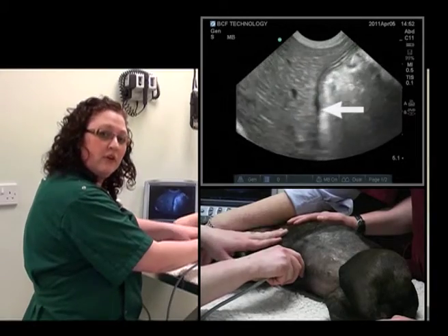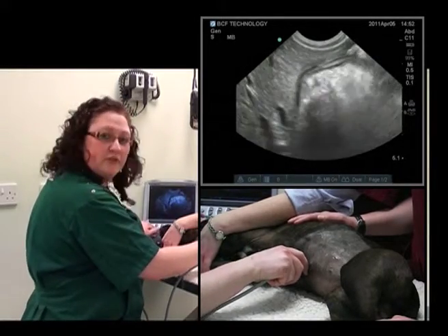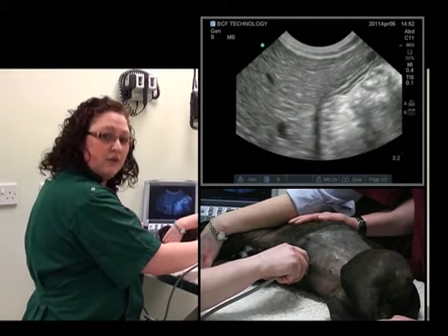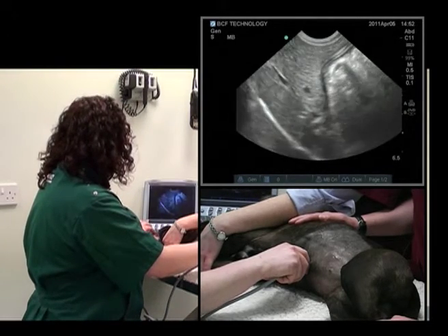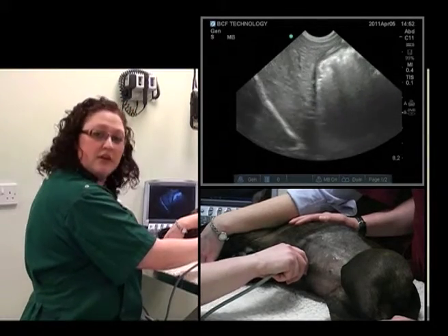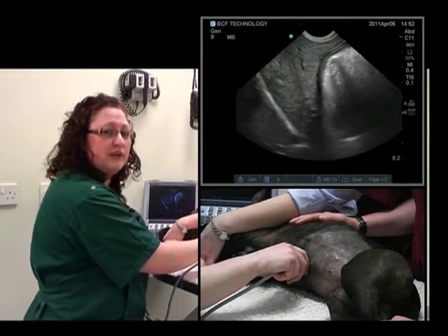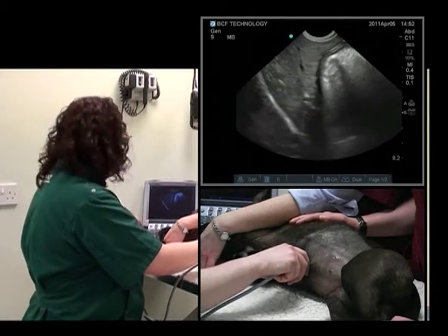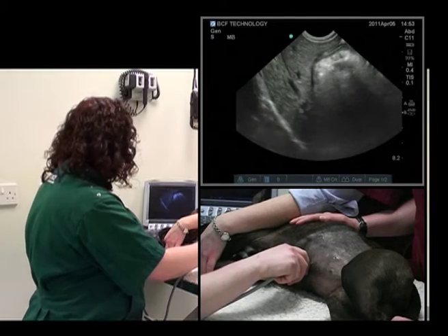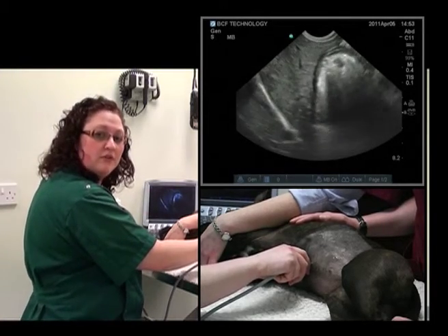The things we automatically need to adjust on our monitor are the time gain compensation, the overall gain, and the depth. We'll start off with the depth — there's too much of the liver on the screen — and now it's occupying about three-fourths, which is just right. Now we'll look at overall gain; it's very important that this isn't overly bright or overly dark. And finally, time gain compensation. All of the parenchyma of the liver in view on the screen is homogenous.